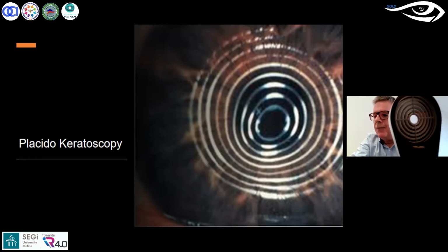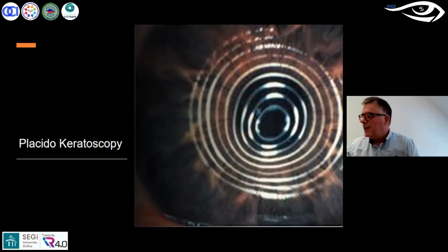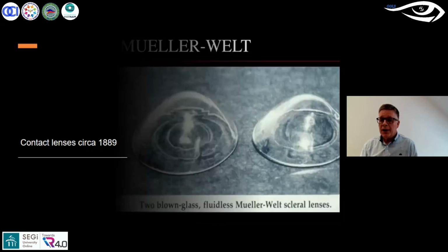Okay, and this was a fabulous tool. I've worked with this in practice. It's held just a few millimeters away from the ocular surface, and certainly ophthalmologists post-corneal grafts were using these instruments quite widely prior to the advent of computers. So what did computers do? Well, they stopped us using an old-fashioned material, which was plaster of Paris.